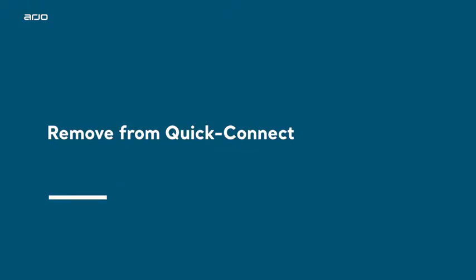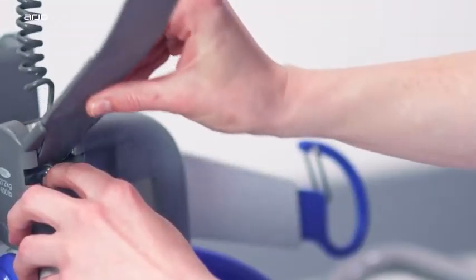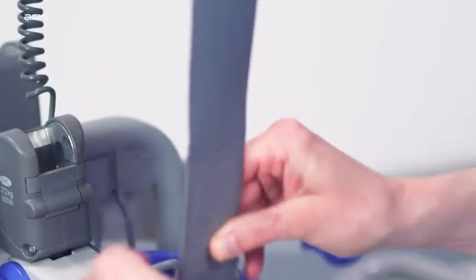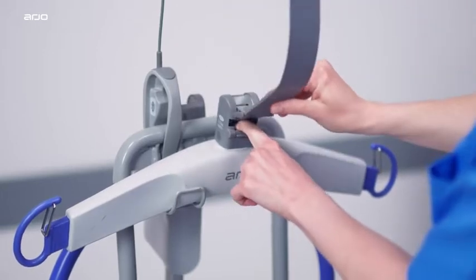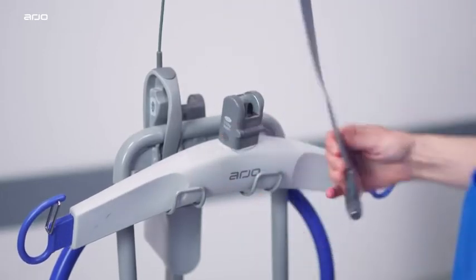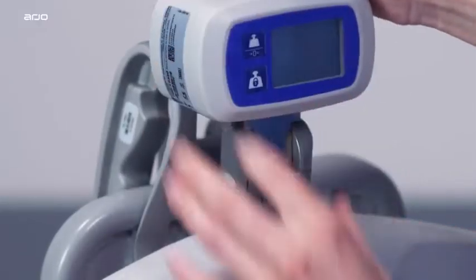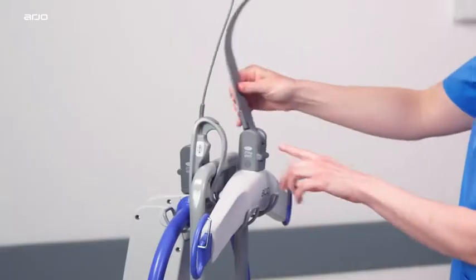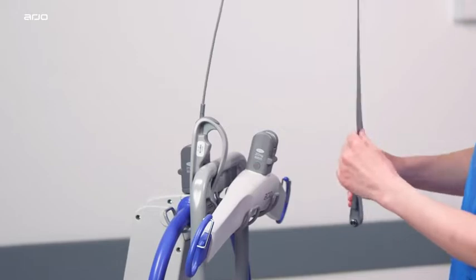Remove from Quick Connect. If using a PDPS, detach the cable from the back of the Quick Connect housing and then disconnect the cable. Open the latch that locks the hook in place by pressing it. Rotate the spreader bar or scale up towards the latch, depending on which one you want to remove. Move the spreader bar or scale to disengage the hook away from the pivot. Pull the spreader bar or scale downward, out of the Quick Connect.